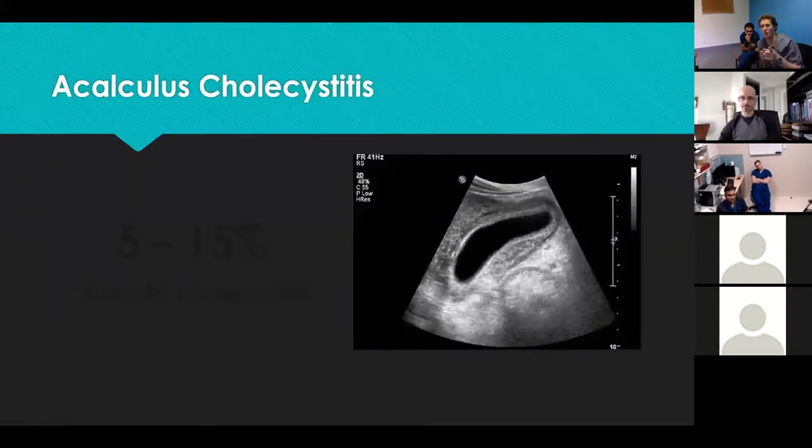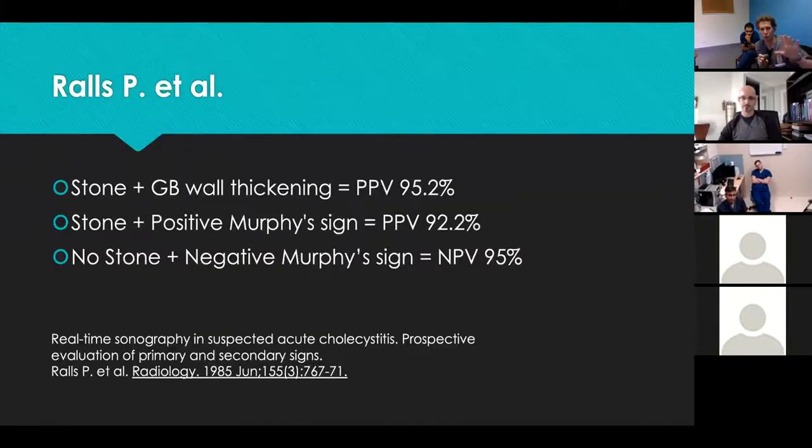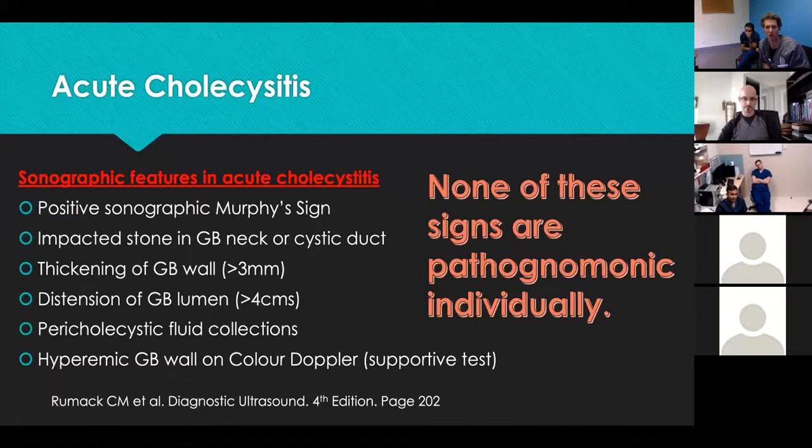Payam, that's really important. That's certainly come up in the exam before, those two slides that you've had. I think that's probably the most common questions that have been asked regarding biliary ultrasound and the DDU. Those things, the sonographic features of it and the sensitivity and specificity things. So thank you for bringing that up.